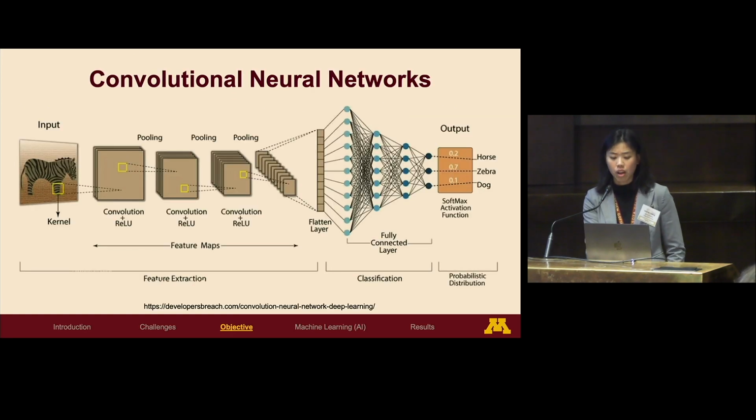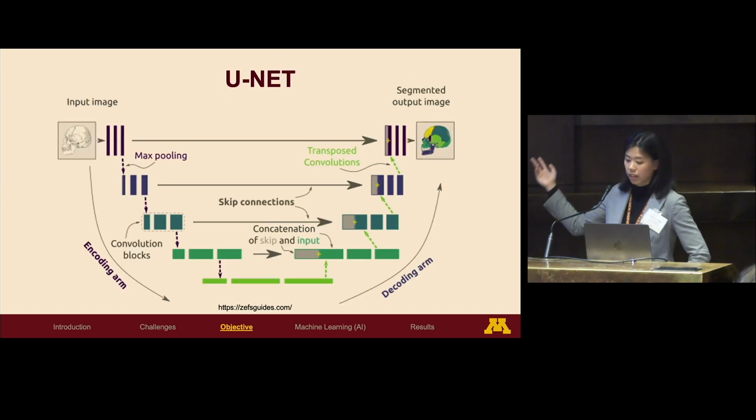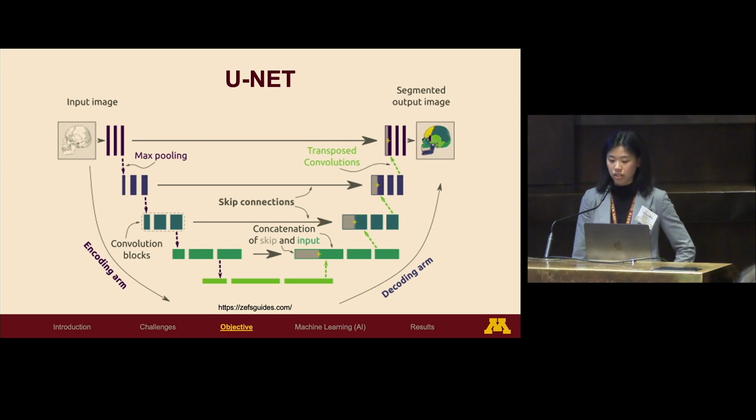For many years, convolutional neural networks, CNNs for short, were the mainstay algorithm for analyzing images. They enable automated tasks like image classification, object detection, and basic segmentation with higher accuracy than the previous fully connected networks. However, CNNs work primarily in 2D and are limited in handling the detailed 3D spatial relationships necessary for accurate segmentation in medical imaging.